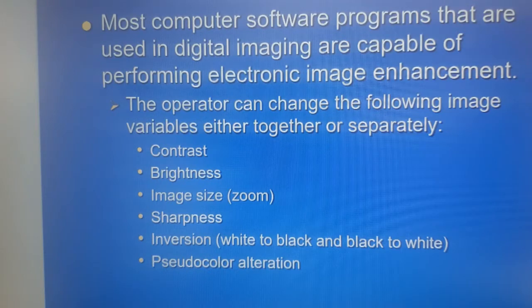For example, we may want to see or perfect the severity of the caries on a particular tooth. We'd maybe perform inversion, either white to black or black to white onto our X-ray, like I said, especially for purposes of viewing caries, even our periodontal ligament spaces.